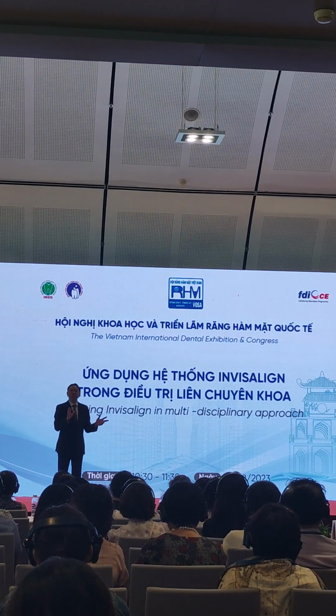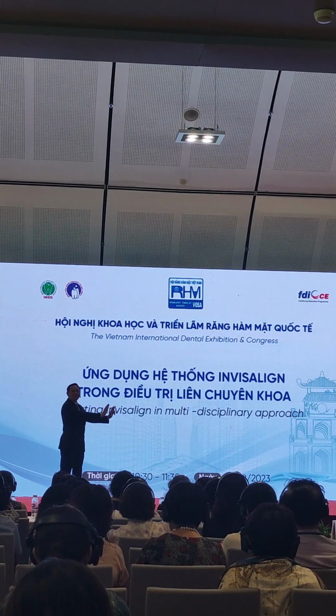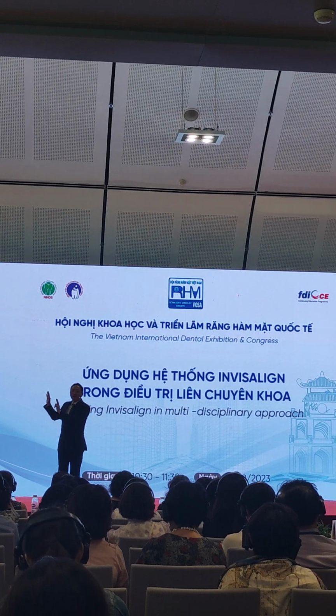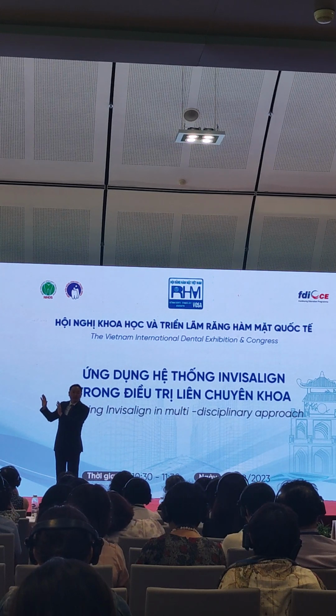For aligner treatment, no matter whether we talk about orthodontic force or reaction force, everything is about contact between the tooth and the aligner. Probably you're pushing the mesial-facing surface of the molar backward, and the distally facing or palatal surface of the incisor is helping you to give the contact and the reaction force.